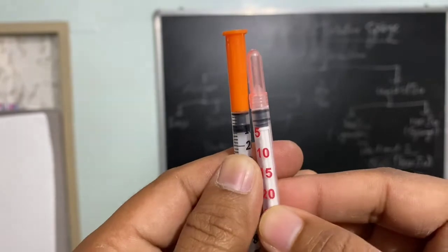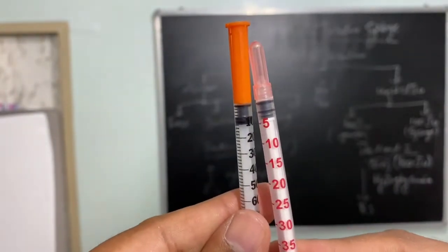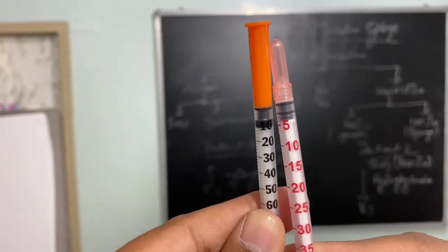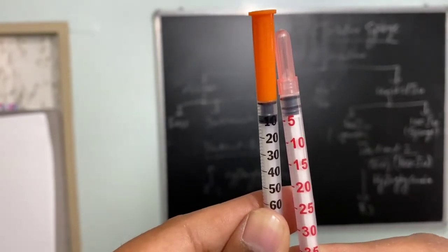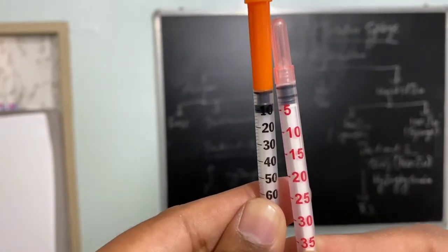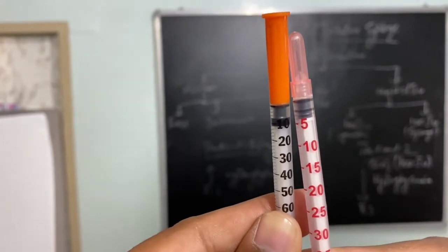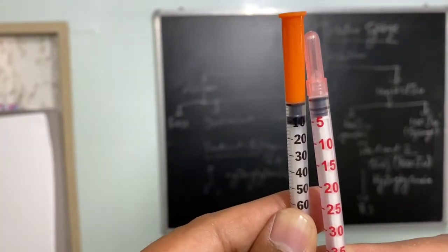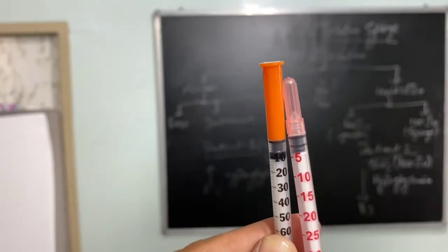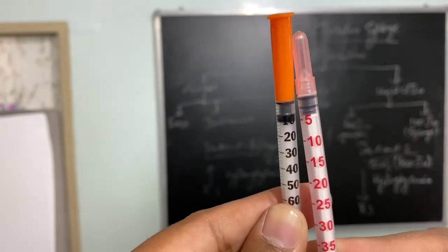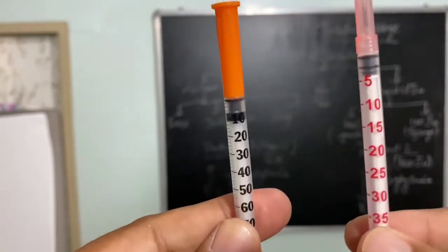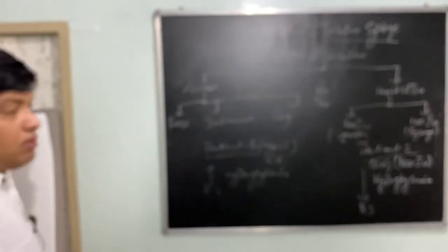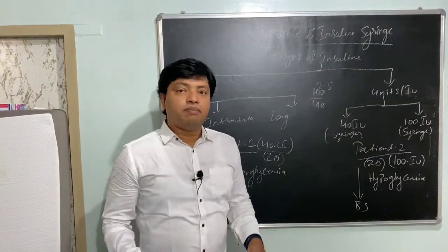If we keep the two syringes side by side — 20 units marked on the left (40-unit syringe) and 20 units marked on the right (100-unit syringe) — you can see the difference. In the 100-unit syringe, 20 units is only a small amount. In the 40-unit syringe, 20 units is much more volume. So there is a clear difference in the volume drawn for the same unit marking.